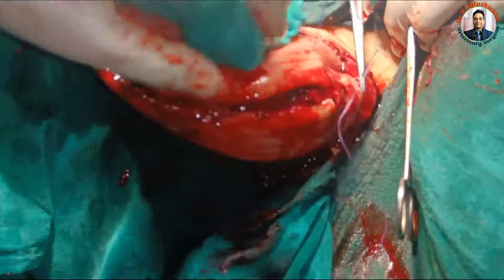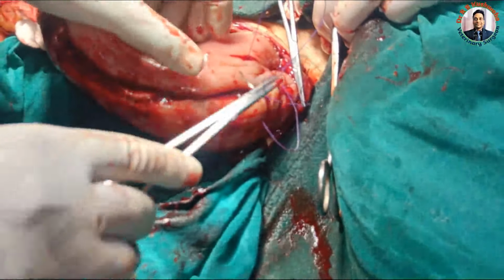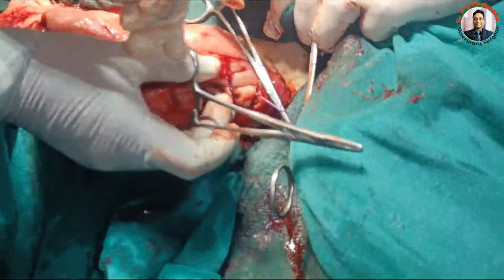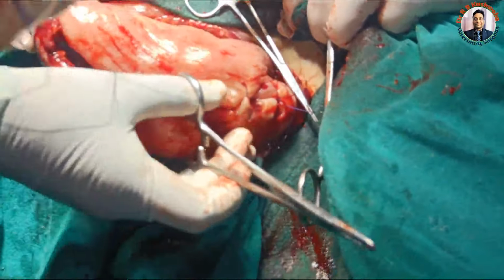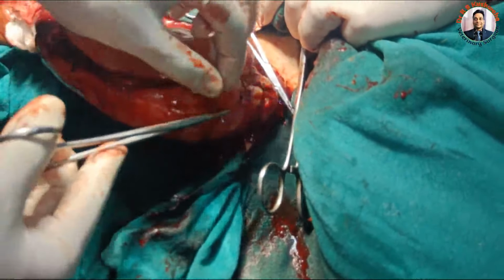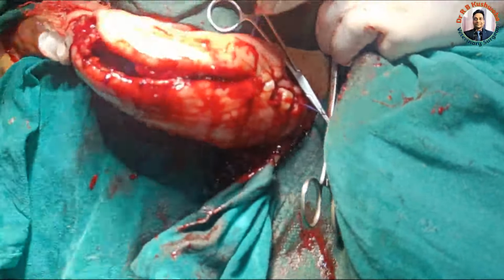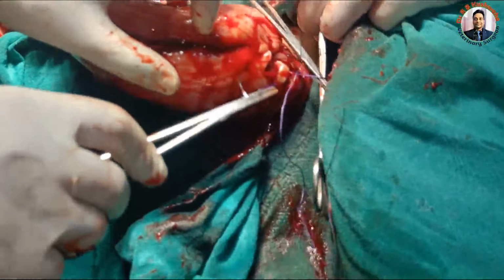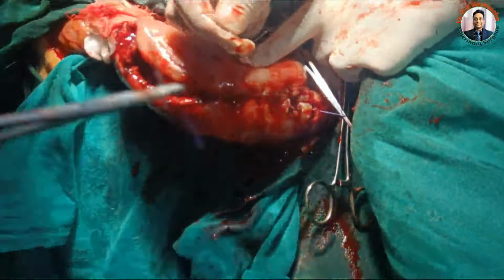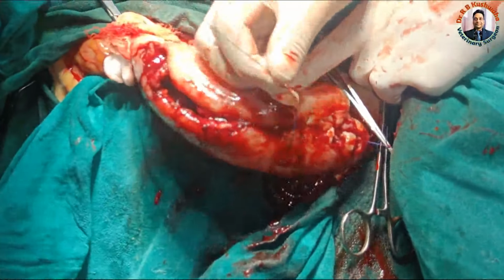Now you could see this is the tear. This is the reason why I said that because of this leathery nature, the holding power of the uterus has decreased. So here we push slightly, yes, it is still tearing. Either we have not taken the history properly or the owner hid something. We thought before surgery that it would be a full term, but it is not full term. So here I am not applying too much tension, simply opposing like this.